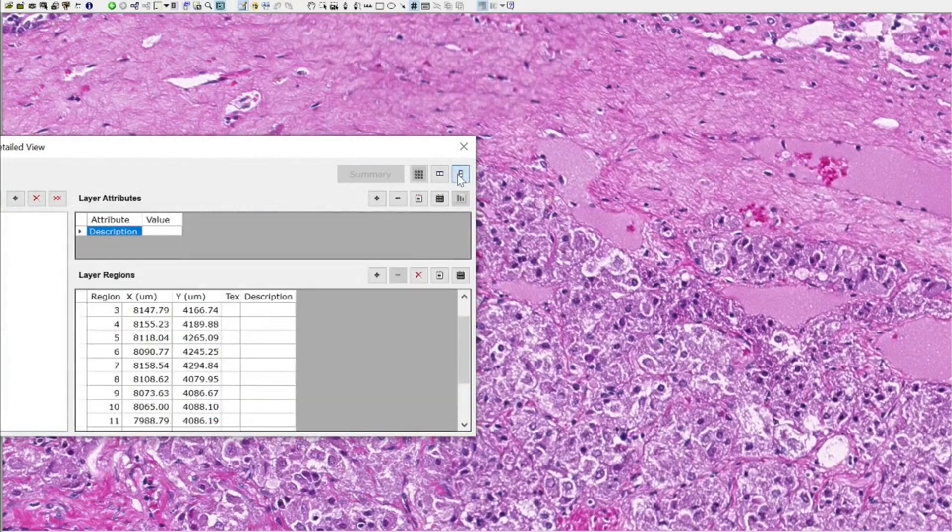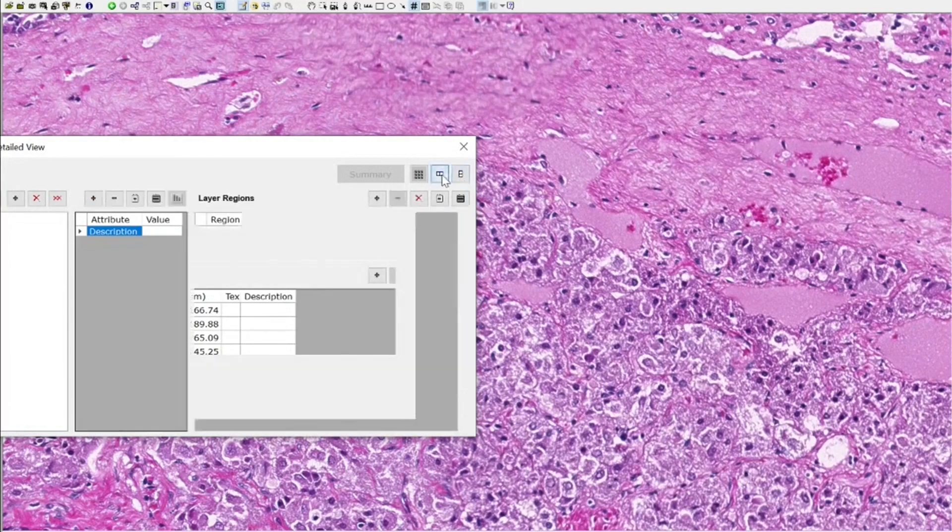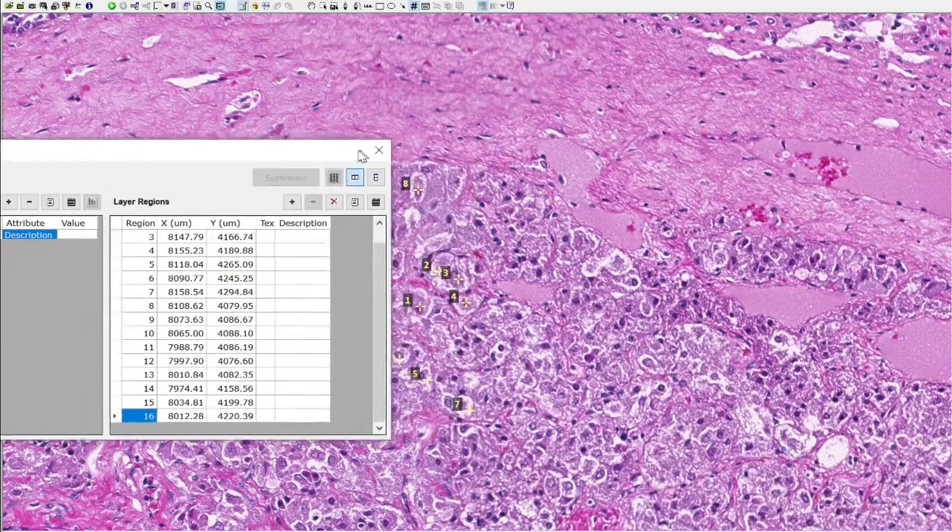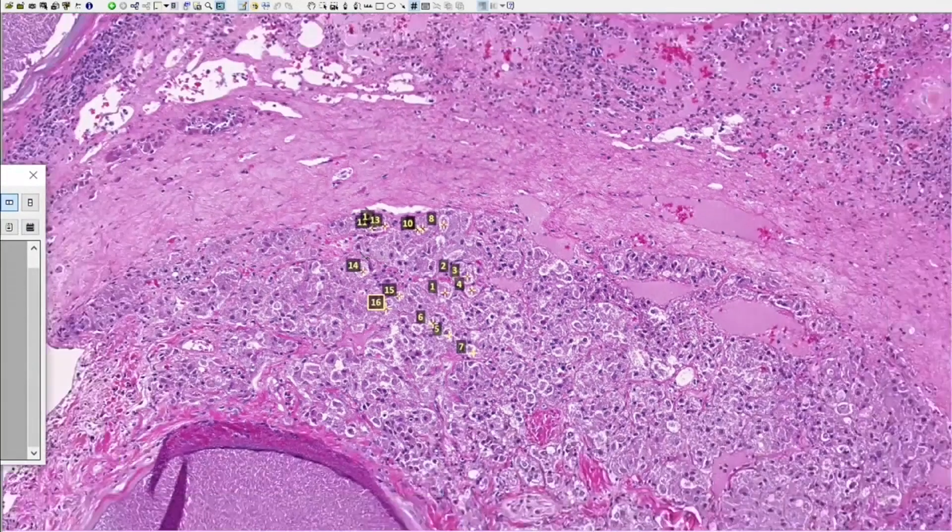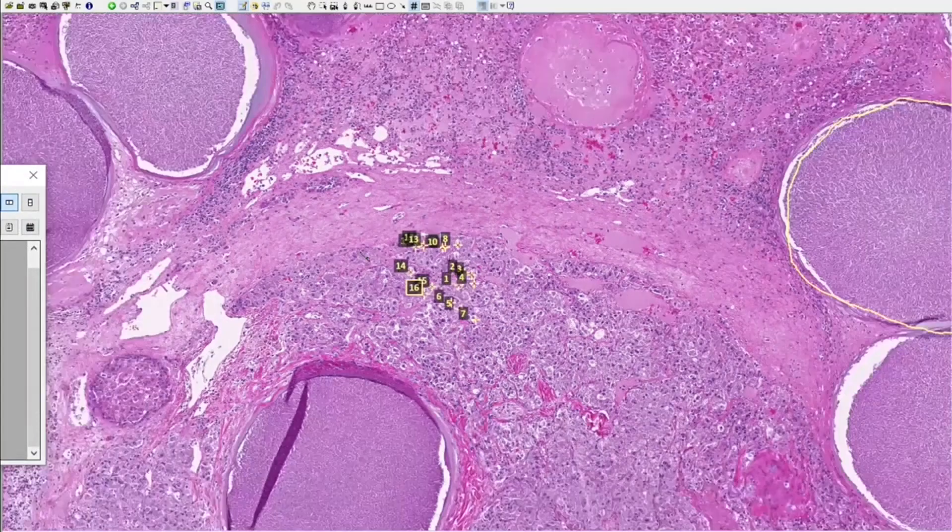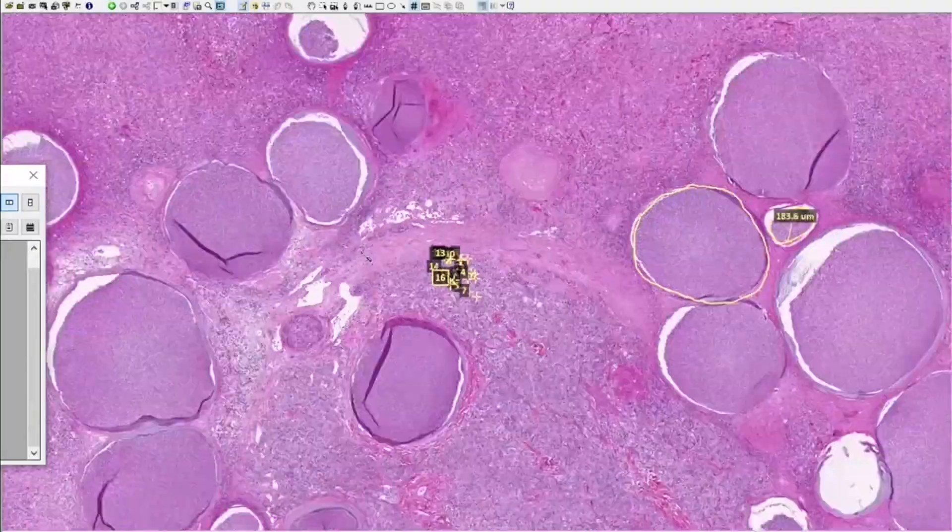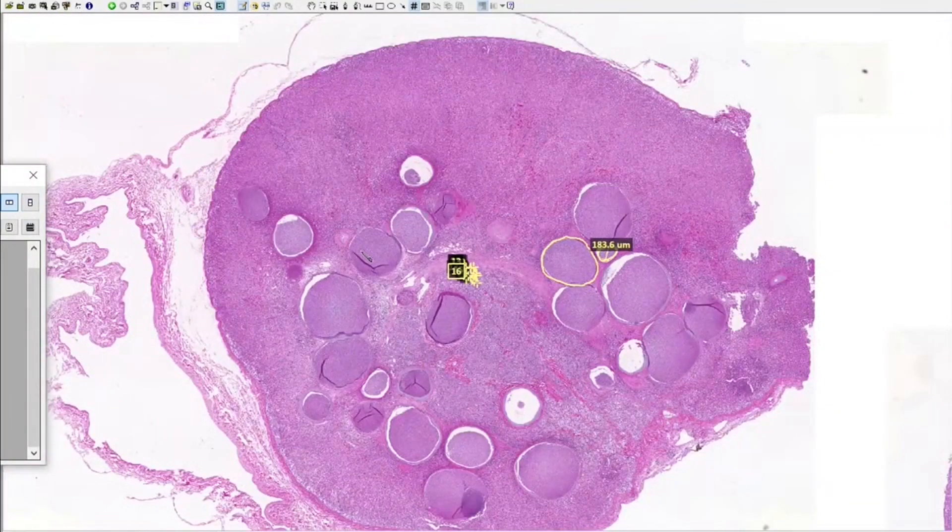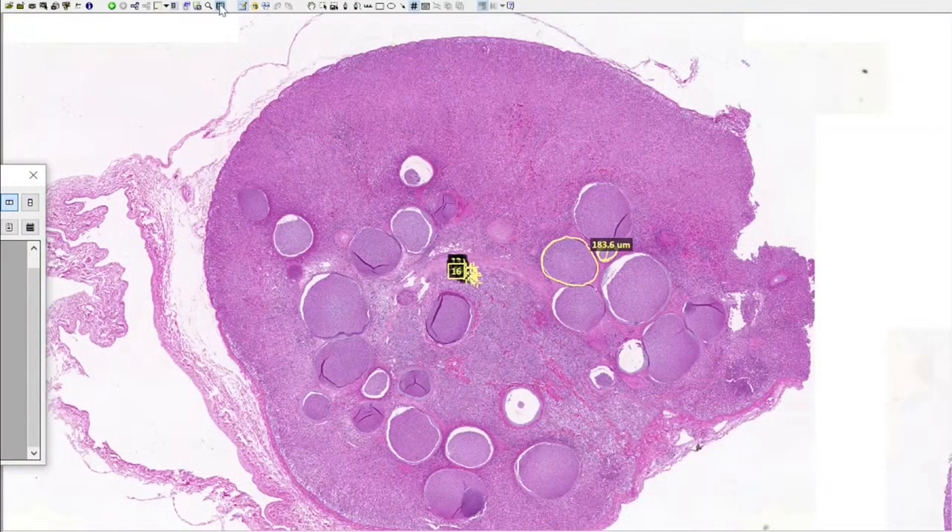You can change the view to vertical and horizontal. I don't see much use for that. When you close this image, let us exit the full screen view.